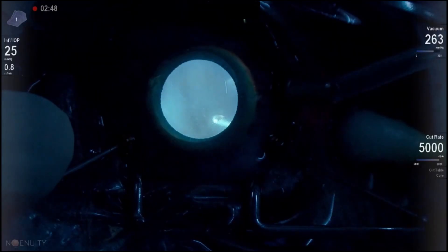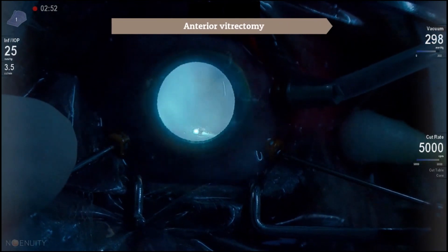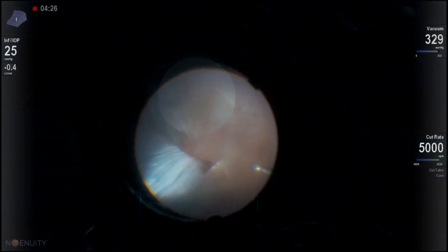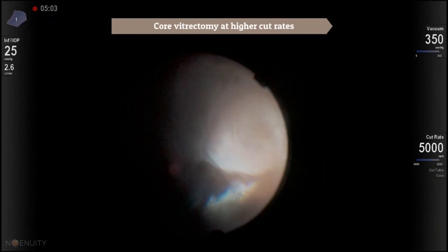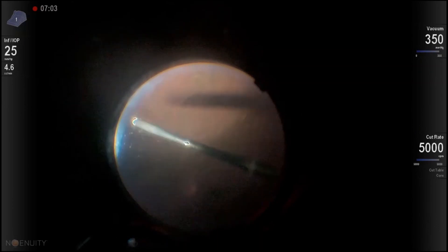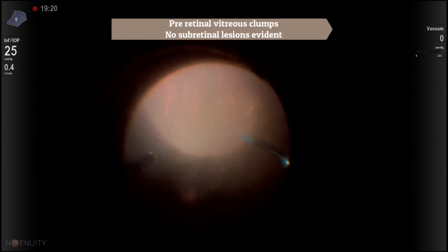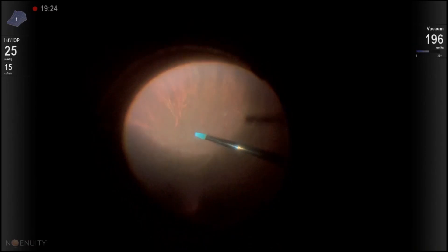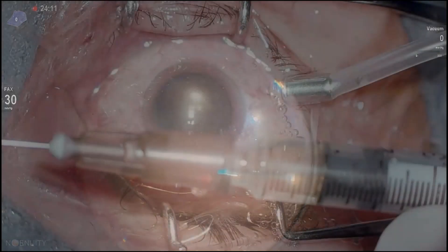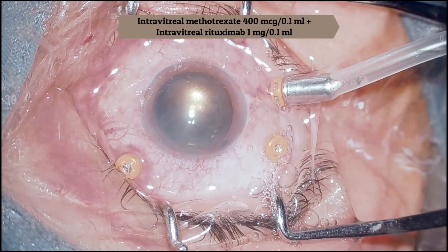23-gauge vitrectomy was performed in OD. Since the diagnosis was confirmed from OS, sample collection was not required from OD, and vitrectomy was performed at high cut rates. Pre-retinal vitreous clumps were removed with a flute needle. Underlying retina did not reveal any sub-retinal lesions. Fluid-air exchange was done, and intravitreal rituximab as well as methotrexate were injected through the sclerotomy.